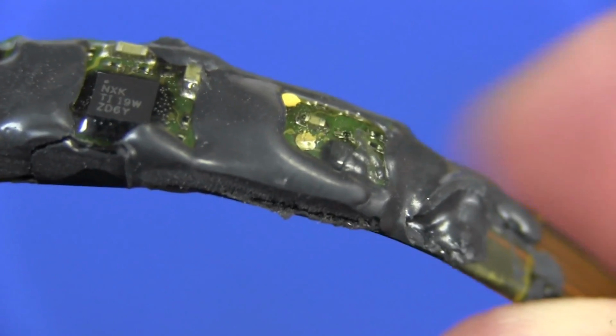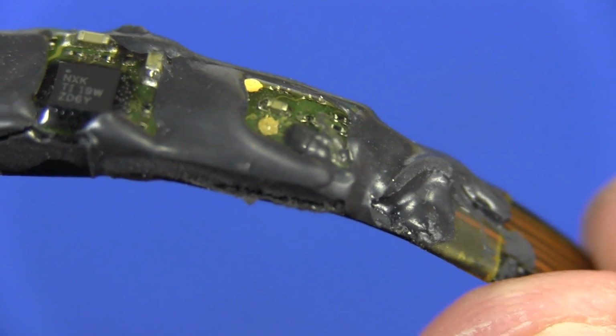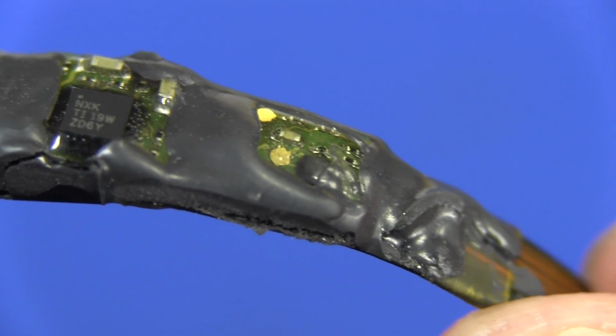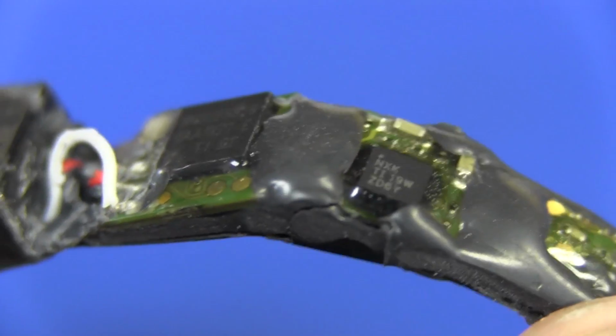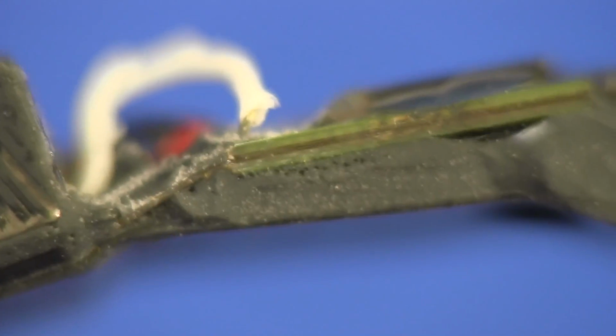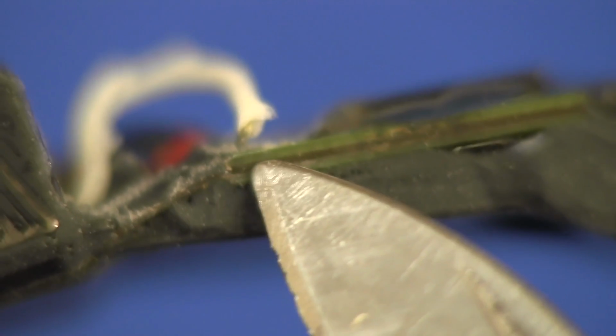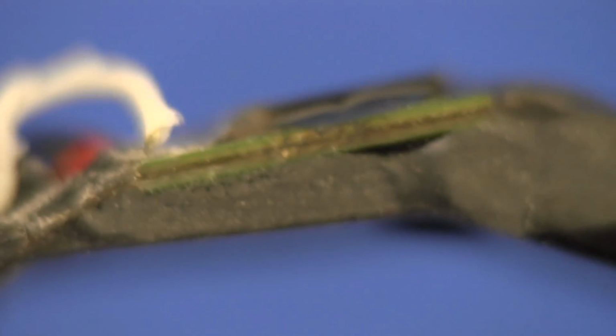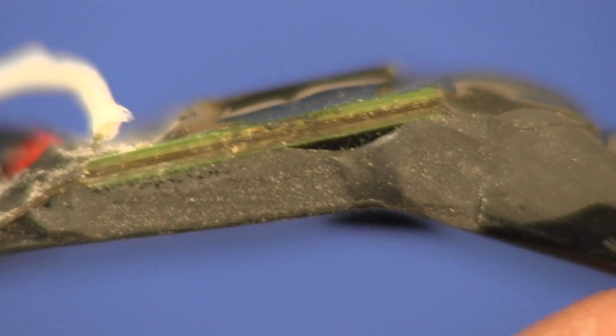But yeah, it all looks a bit of a mess because of all of the rubber potting compound around there. You can see more test pads, you can see little tiny 0201 resistors in there, and a few surface mount caps. But there you go, you should be able to see the sandwiched construction of the board in there. If you look closely, you can see that that dark material in the center is the flex, which then continues out over here, and then it'll continue out the other side there, even though it's not obvious. And then you've got your regular fiberglass board above that. So that's not actually a flex board as such. That is one of those hybrid flex in the middle type construction techniques, just to join multiple boards together.